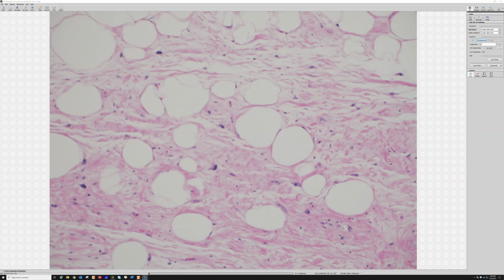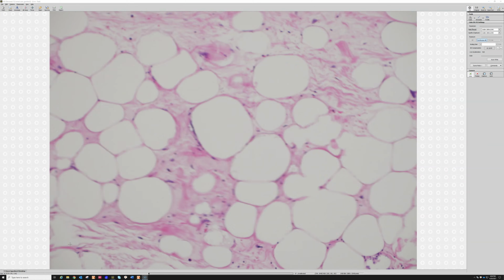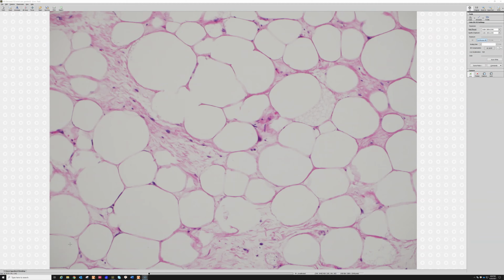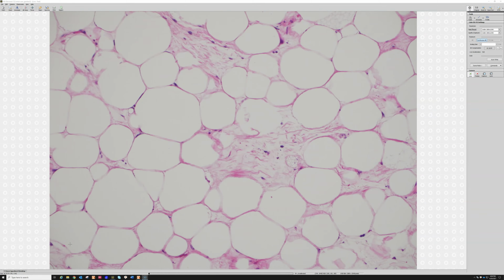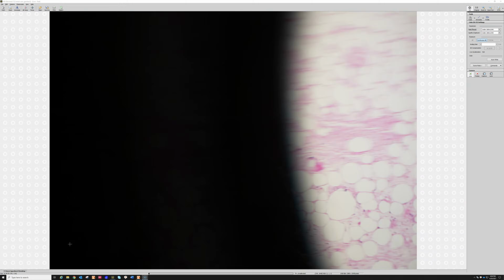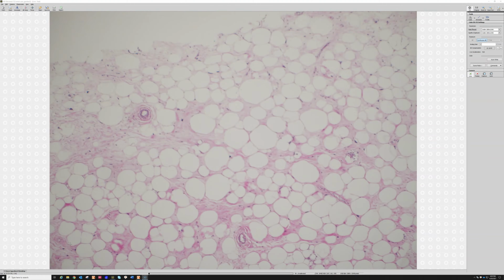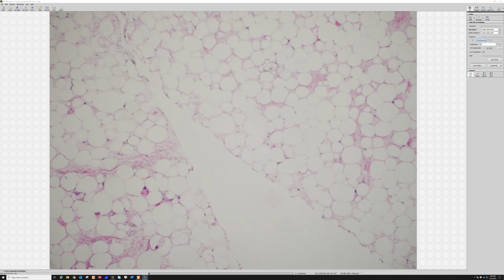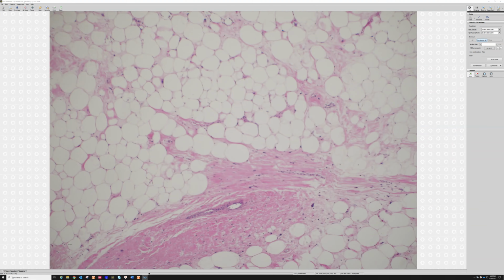And why that's helpful is that in some cases, fatty tumors can have fat necrosis. Both benign and malignant fatty tumors can have pockets of fat necrosis, and the histiocytes in pockets of fat necrosis sometimes overlap, and their nuclei can mimic the hyperchromatic cell of well-differentiated liposarcoma. And I saw an area earlier. Let me go back and look for it.